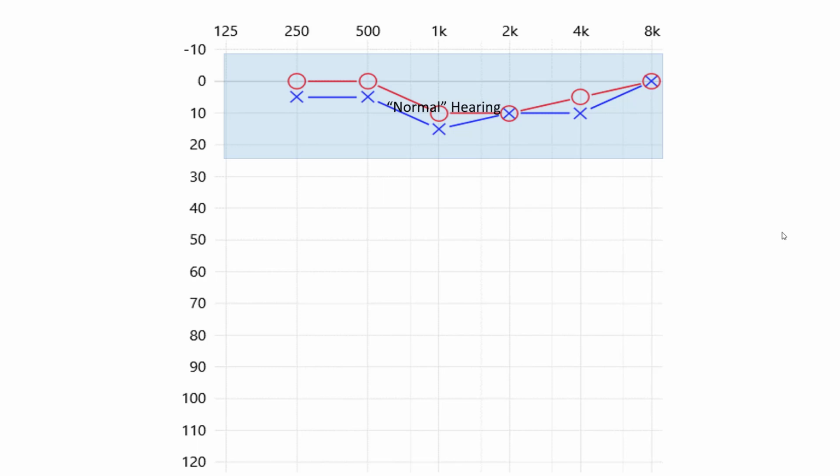And if you look at the further description on the page, you'll see what happens is that the sound is a movement of air particles which moves the eardrum or tympanic membrane, vibrates the ossicles or ear bones, vibrates fluid within the cochlea, which is attached to that final ear bone, and that vibration of the fluid in the cochlea or inner ear will vibrate tiny little hair-like protrusions in the inner ear, which will allow an electrical current to travel through the membrane, creating action potentials, creating little electrical excitations which travel up the hearing nerve and which are interpreted at the level of the brain as sounds.